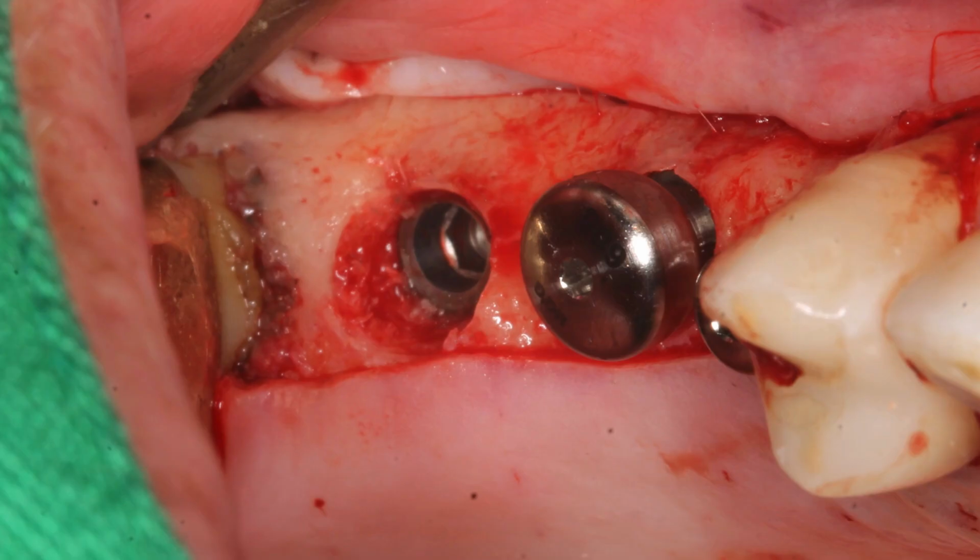Let me elaborate. This is the most distal implant, the most posterior one, which is placed quite deep. And of course, profiling was essential. So the profiling of this nature can be done precisely using this device rather than with the freehand. It is possible, but it's a little bit hair-raising when you get a burr fairly close to the implant platform, and that's never a comfortable thing.